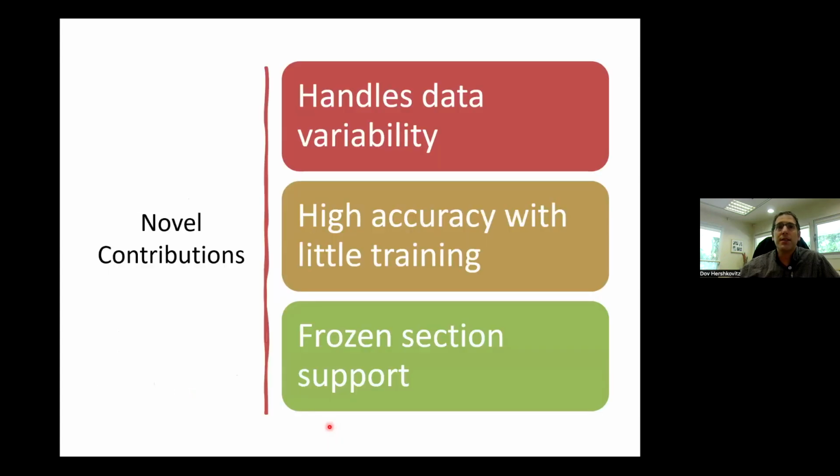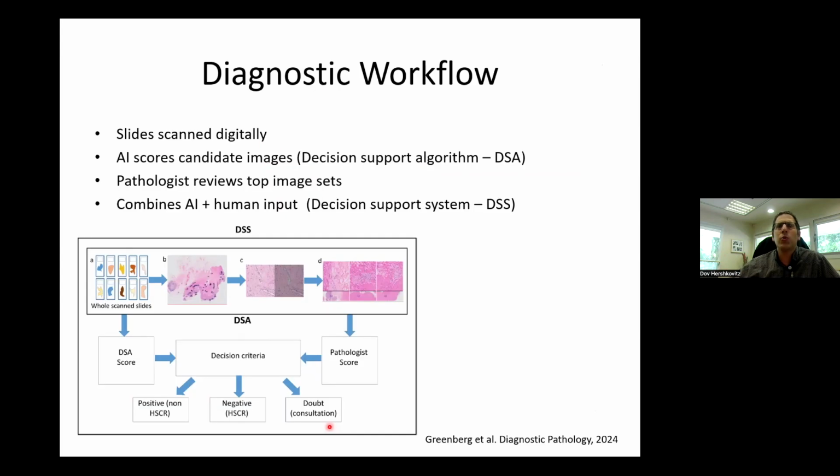These are the three options based on the pathologist and the algorithm score. Using this, we were able to achieve 100% accuracy, some directly based on the criteria, and some after consultation. Again, the consultation was only on one PDF-sized set of images.